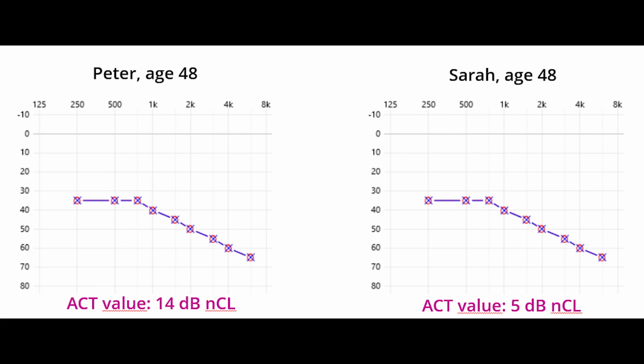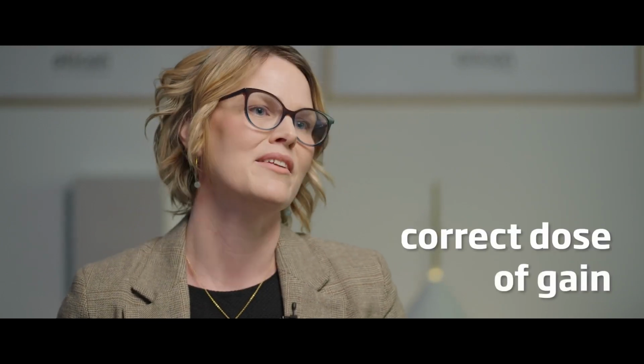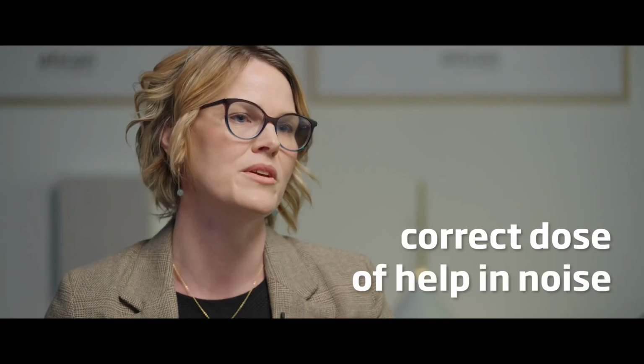And that's the whole purpose, because you don't want to over-prescribe help or under-prescribe help. So in essence, it should make it easier to send a client out with the correct dose of gain and the correct dose of help from the hearing aid. Yeah. So a better first fit, all in all.